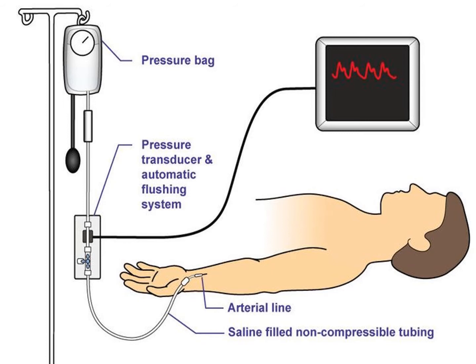Very, very bad. And let's say we have this patient, the head of bed's at 30 degrees, which most ICU patients are, and we lay them flat to take them to CT scan or IR or one of those places in the hospital we have to take them to, and we don't re-zero the line when they're laying flat, then we're also going to have abnormal blood pressure readings.